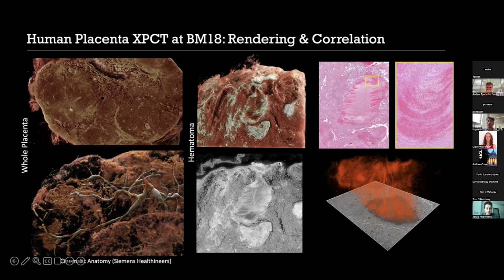You can see it right here, and rendered it here on top. And also, we physically cut it out of the sample after the experiment and did histological analysis to verify that this is the structure we're looking for, and to segment this kind of lamellar structure in your hematoma.